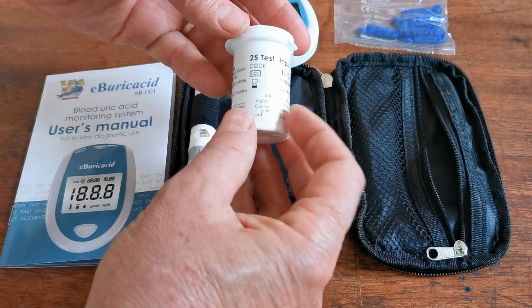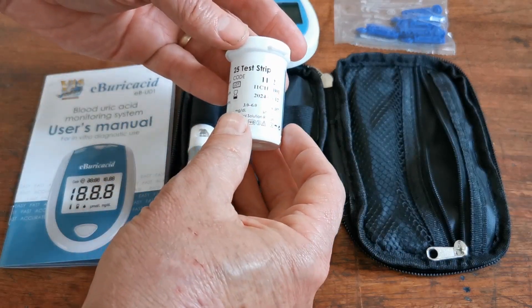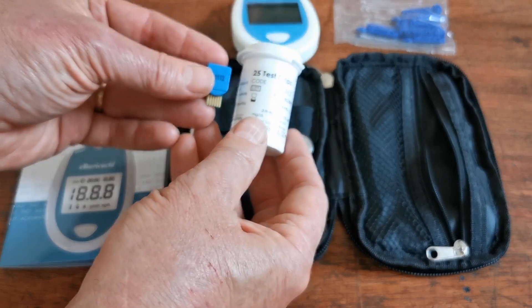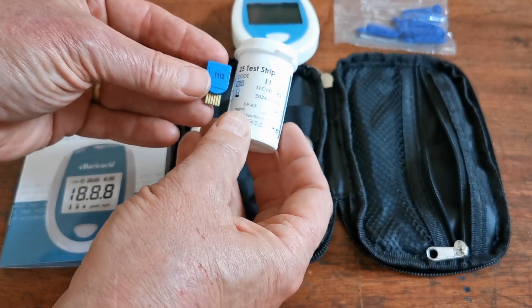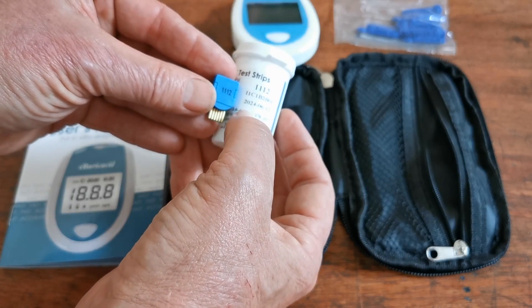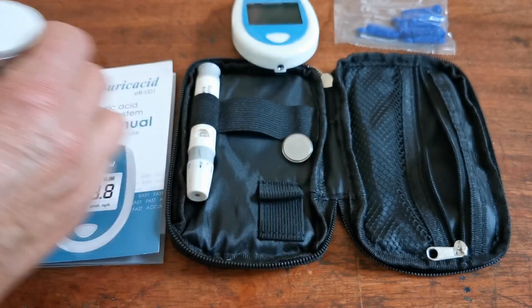You will also have been supplied with a pack of 25 EB-Uric Acid test strips, and inside that box will come the code chip. The code chip number will be the same as the code chip number referenced on the side of the test strips.